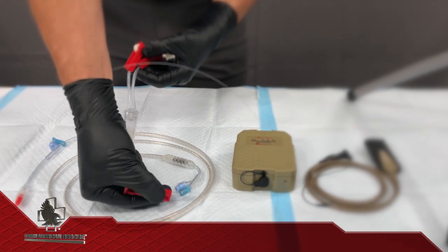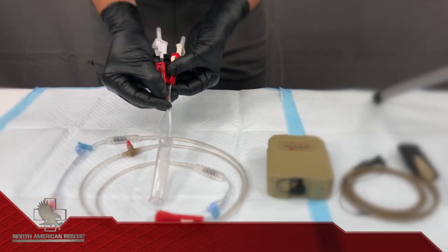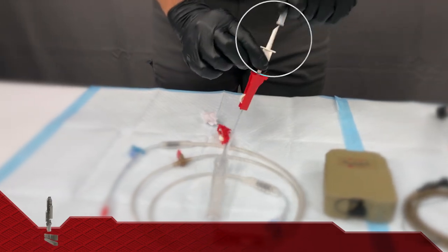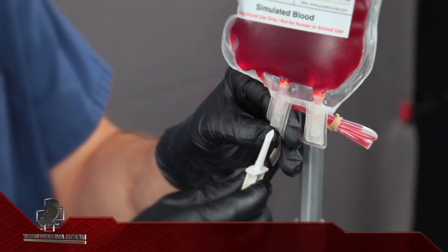Close all three roller clamps, remove one of the caps, and spike a bag of blood.